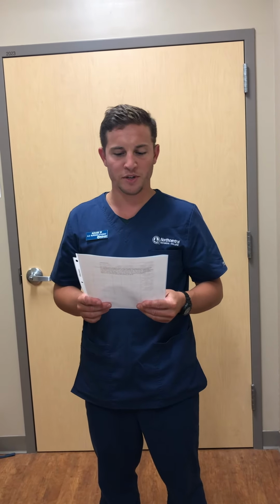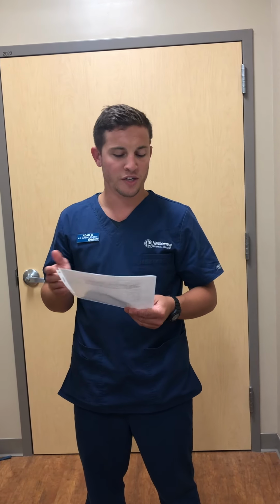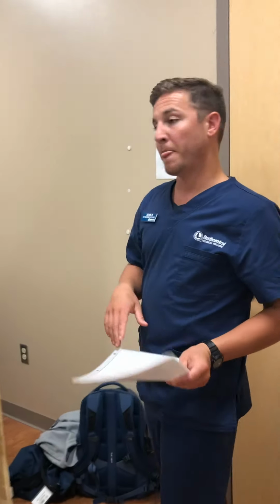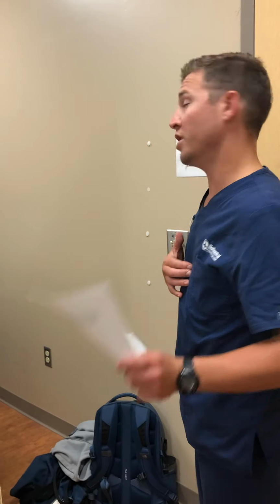So I am looking over my MAR right now. My patient is Mary Smith. Her date of birth is 5/18/1963. I see she has an allergy to morphine, and she has some new orders on here from her physician. She came in with dehydration, so she is getting some fluids, which requires an IV, and we also have some medications as well that require IV push. So I gathered all my supplies, and we're gonna go in and do the procedure here.